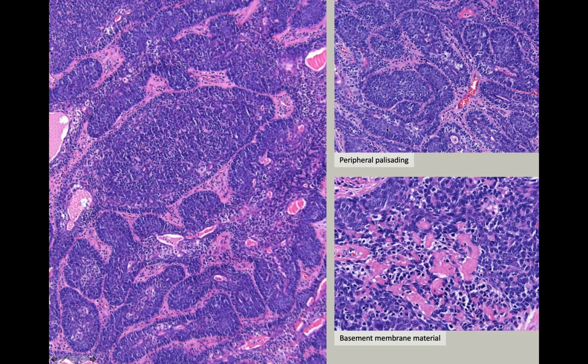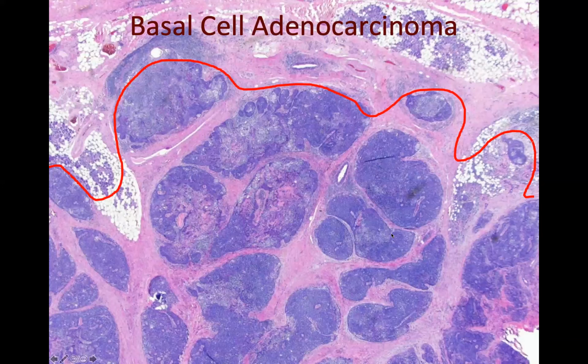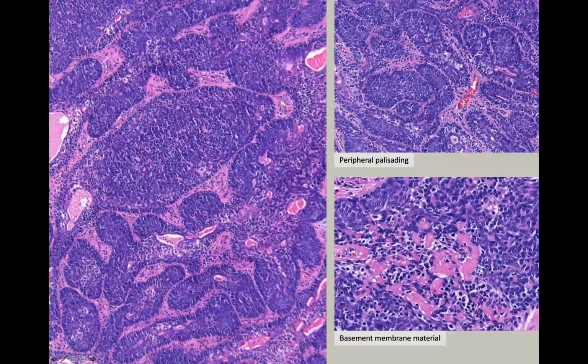Depending on the grade of the tumor, it may appear with low mitotic activity and bland, or again, it may appear with high mitotic activity and more pleomorphism if it's low versus high grade. But again, infiltrative growth is going to be key.